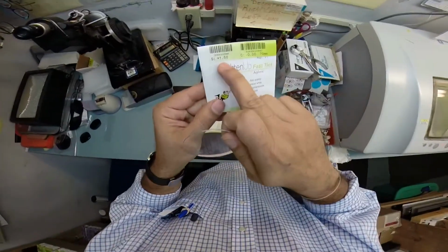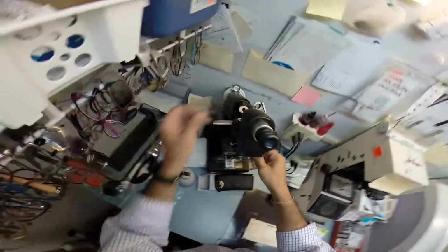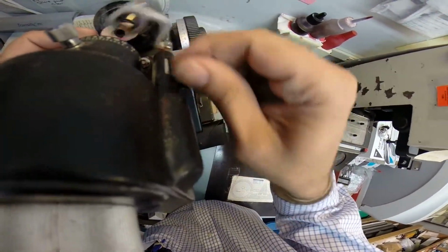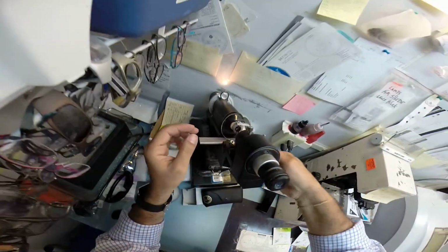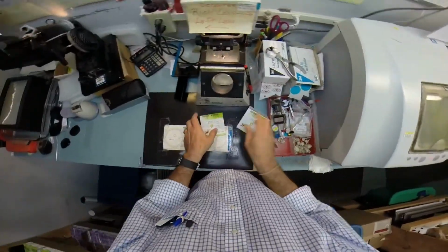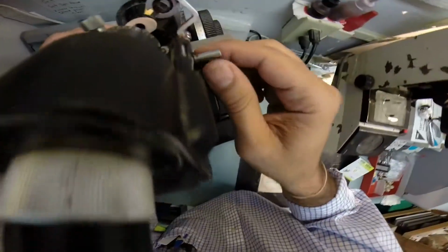So, these are your plus 1.50 lenses. I'm going to put each lens into my Marco 101 lensometer. I'm going to turn it on first. There we go. And now's a good time for you to look at all the dust sitting on top. But what I did is I've located your optical center, and I put 3 dots on your lenses. But this time, because you have no astigmatism, I just need to use the center dot. I'm going to do the same thing now with the other one.